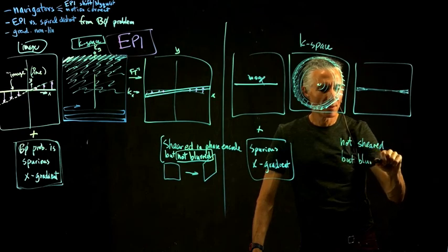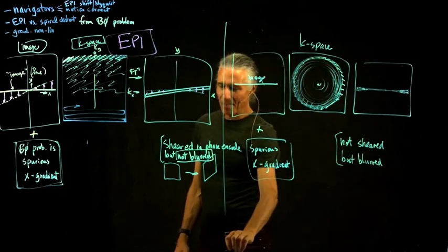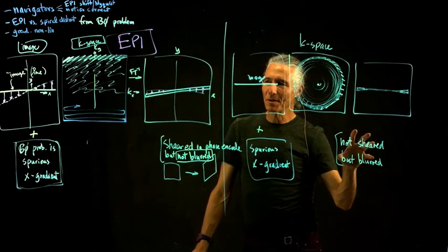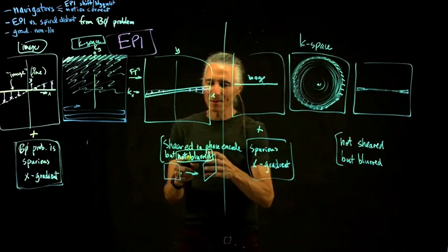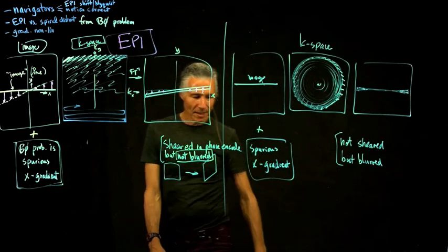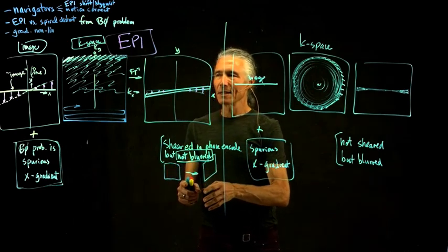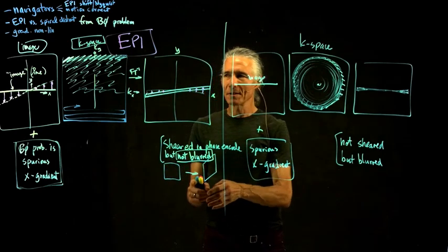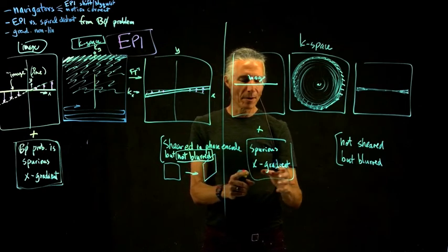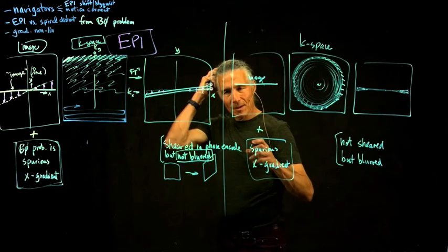And because of that, people have tended to dislike it, sort of unfairly in my mind, because I would almost prefer something that wasn't quite as distorted but blurry over something that was sharp but incorrect. But people have tended to prefer the EPI distortions, sharp distortions, not blurred but distorted, compared to blurred but not as distorted. Now, one thing to keep in mind, both of these can be corrected.